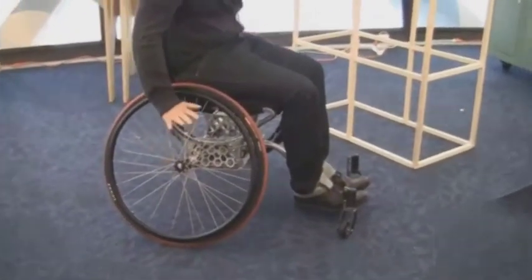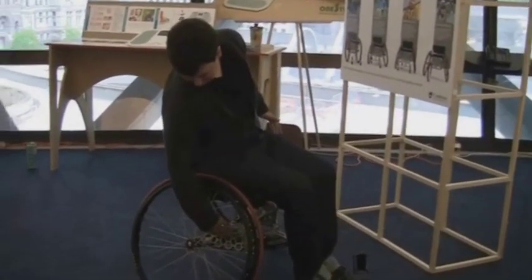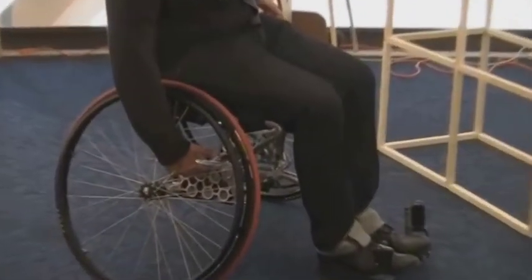Currently, the chair is in sport use configuration. The hallmark is the highly cambered wheels and unfortunately it's too wide to go through most doorways. There's this adjustment casting here which allows you to go from 15 degrees of camber to zero degrees of camber, along with center of gravity position adjustments.